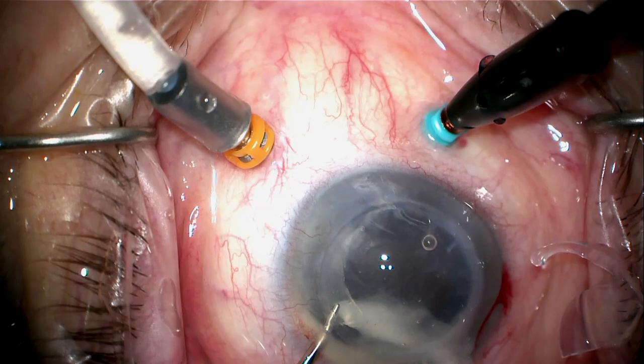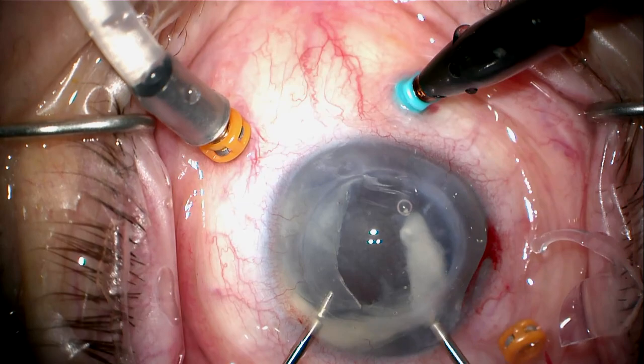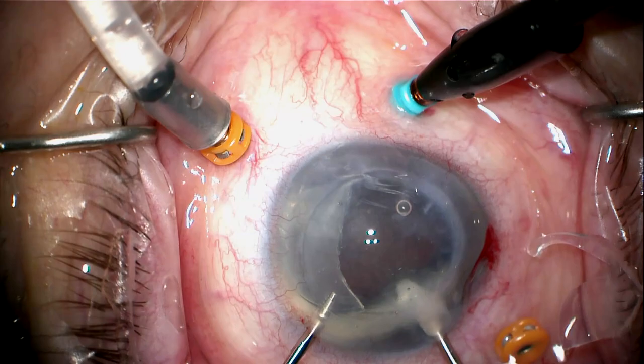Here comes the first half out. I want to be very careful to make sure I get all the Sumrins ring material out, because this can cause significant inflammation. We're going to burp all that out and be careful to make sure none of it falls posteriorly — otherwise I'll have to go back and get it.